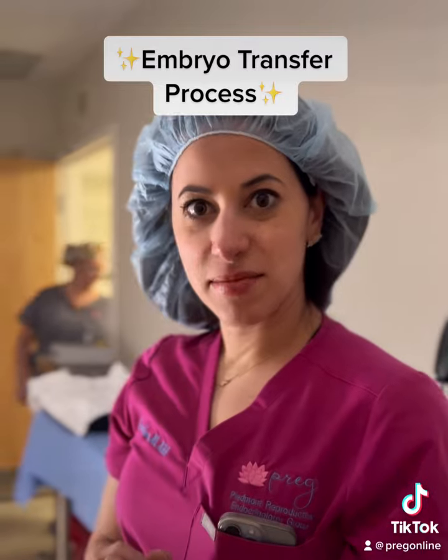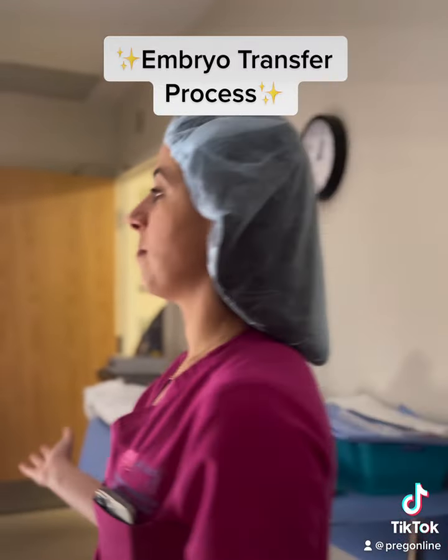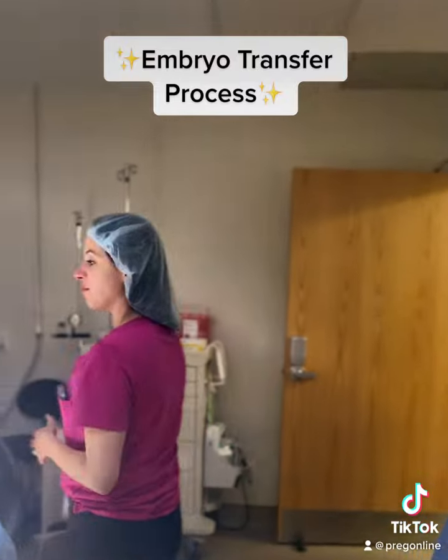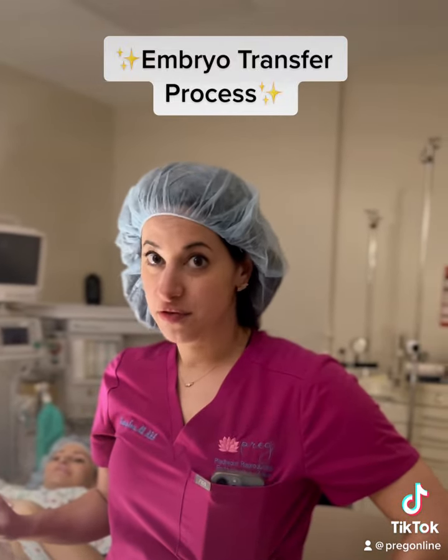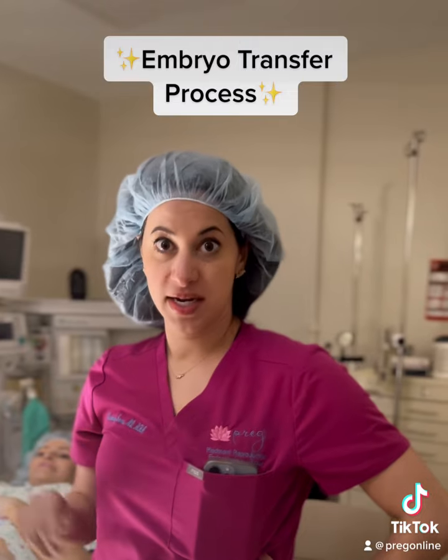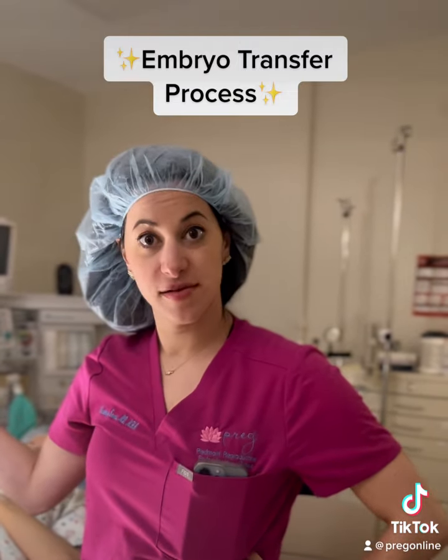In the setting of an embryo transfer, we'd come into the procedure room just like this. The patient would lay down on the table, and she would have a full bladder. The reason we need a full bladder is so that we can perform an ultrasound on the belly and watch the uterus on the screen right there.